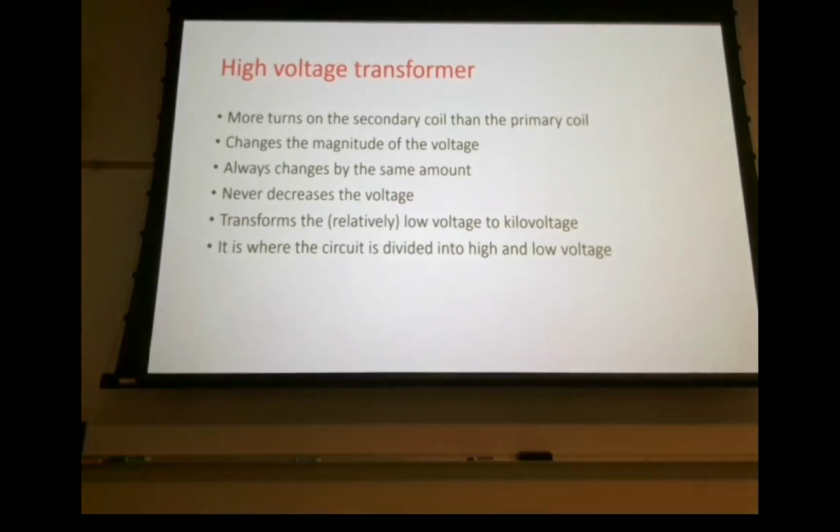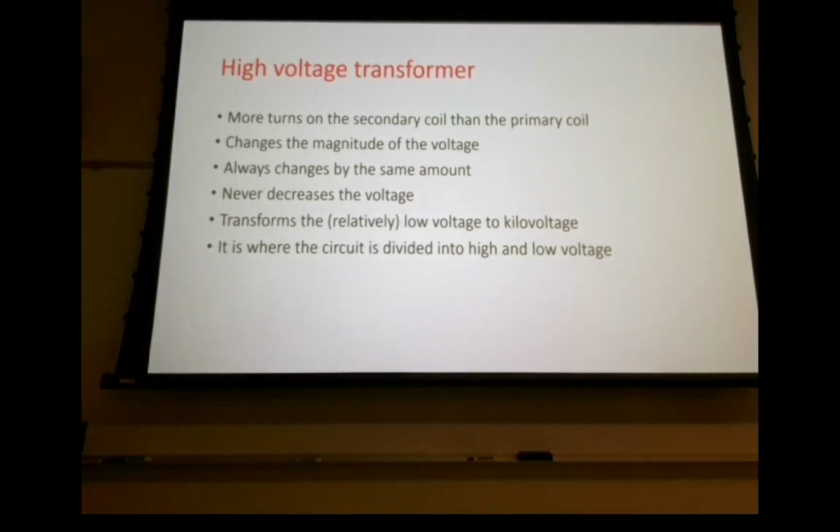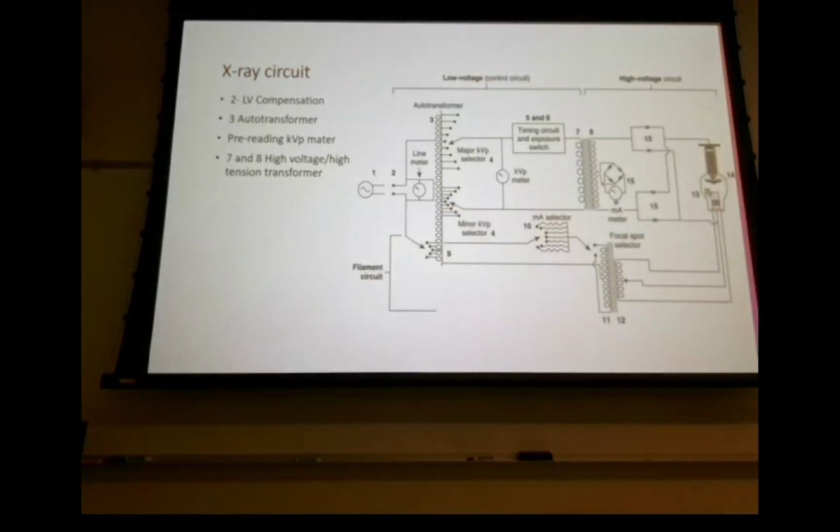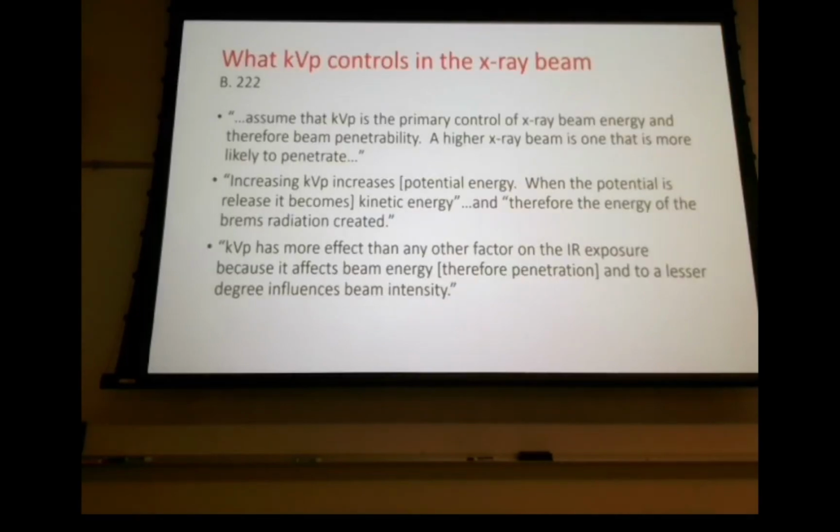All right, so again, this is more of just a summary of what we talked about before: kVp meters and the low voltage circuit. And that's for safety. So just more diagrams, same thing.